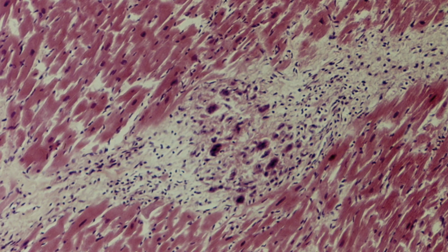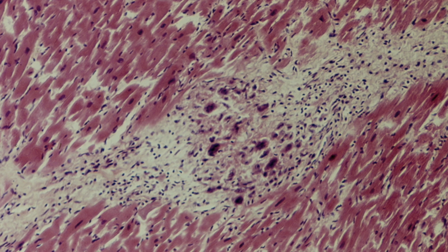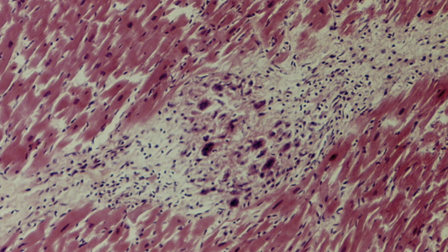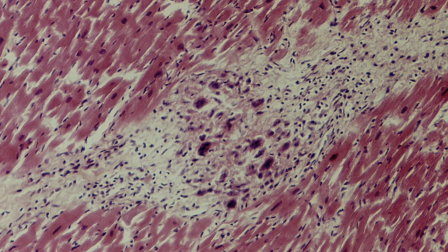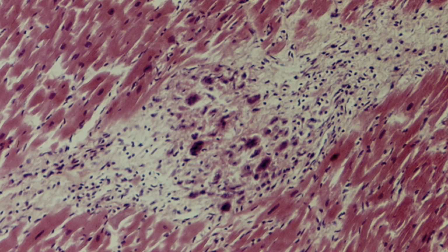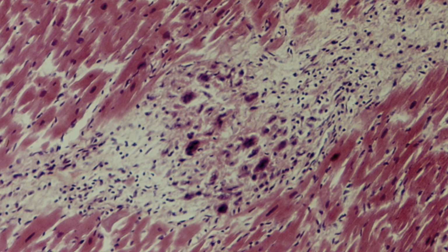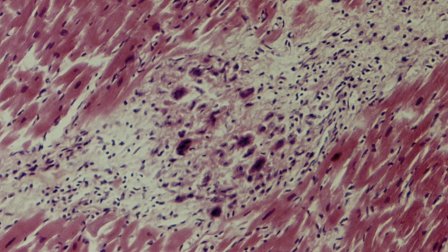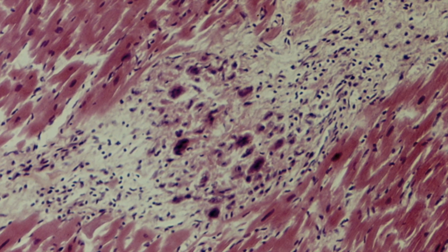Here is a higher power view of an Aschoff body. It is quite well circumscribed, and also you can see that it's just surrounded by a sprinkling of lymphocytes. The other thing that can be appreciated is the presence of large cells with pleomorphic hyperchromatic nuclei.